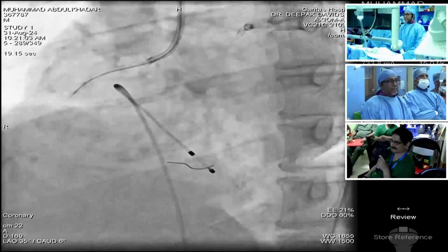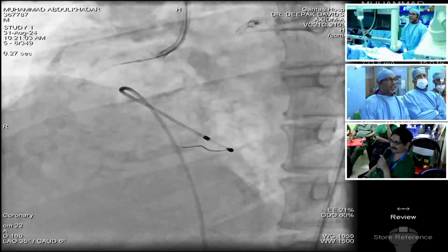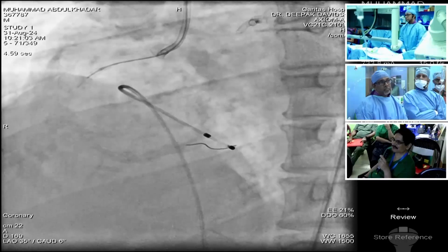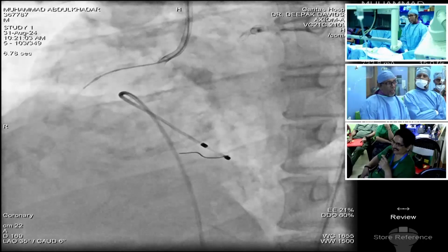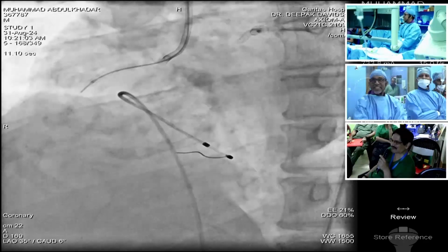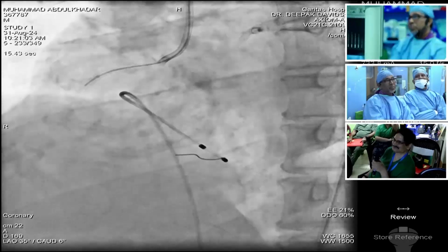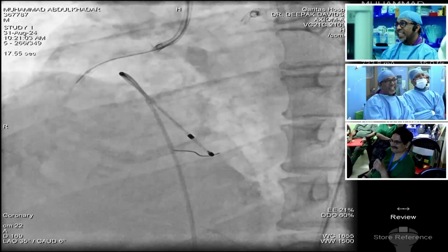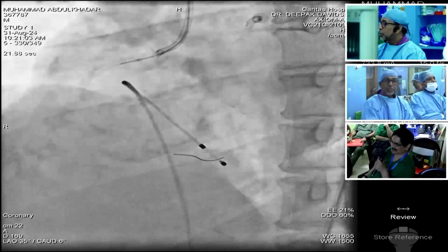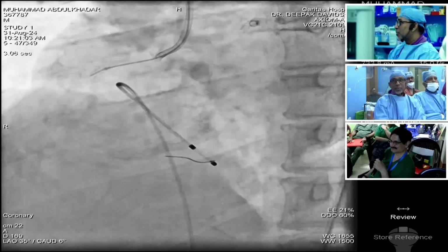Because of bradycardia, you are pulling the burr back and keeping it, yes, closer to the guide catheter. To be frank, not necessary. Because of our previous rota habits, we will do like that. Because initially we have similar type of conditioned reflexes. In between, you want to check some flow there? No, not because of creatinine. It's again, as he told, it's like rota habit.